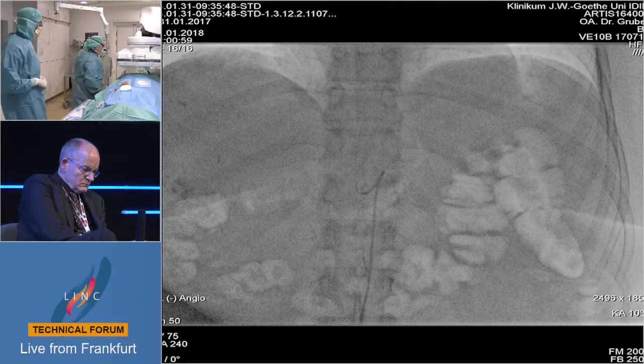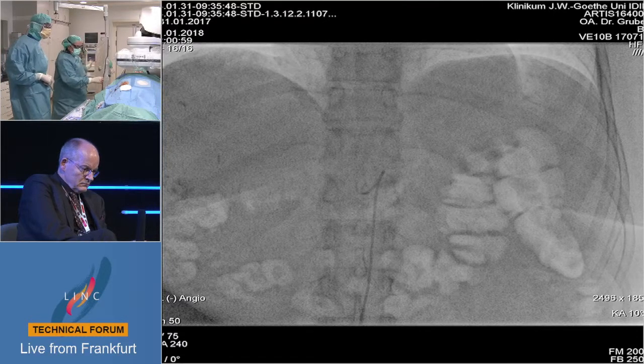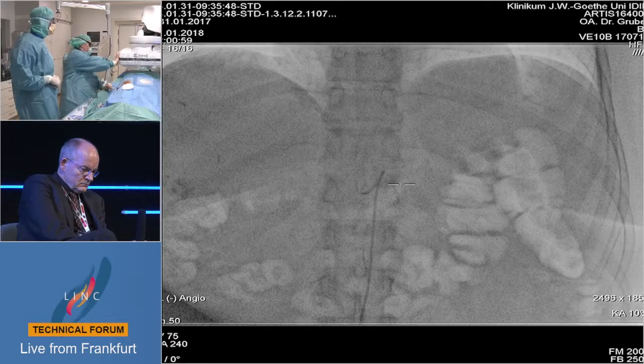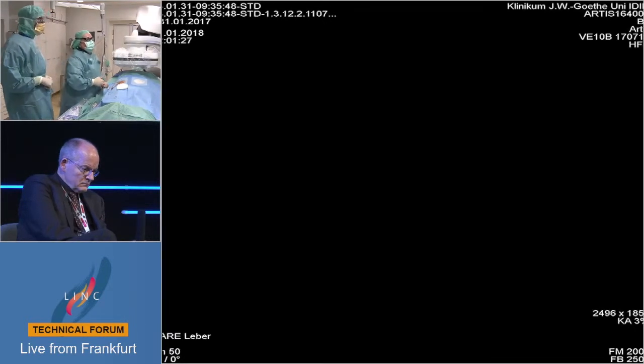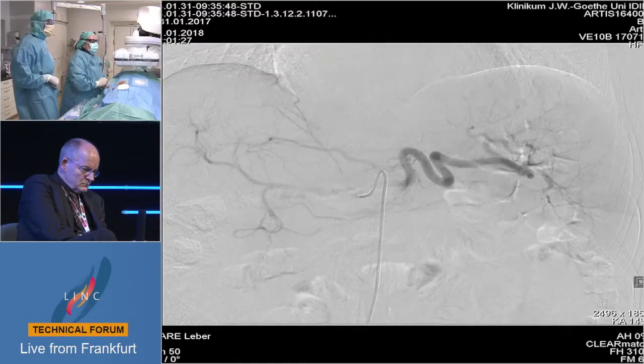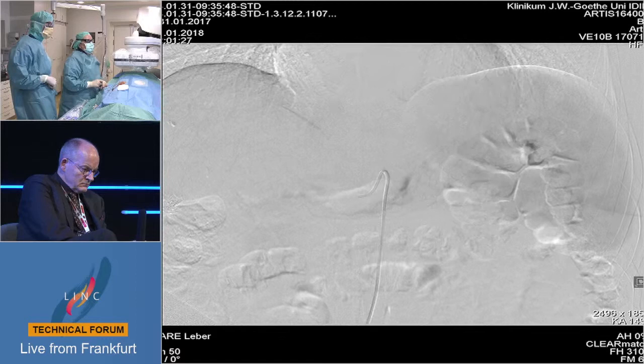So, now we do this with breathing commands. Breathe in, breathe out, no more breathing, don't move. Breathing commands: breathe in, breathe out, and no breathing.